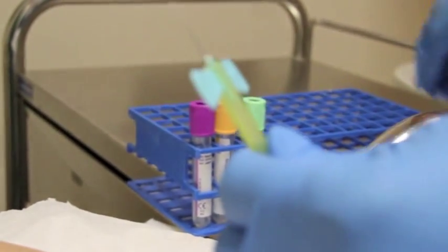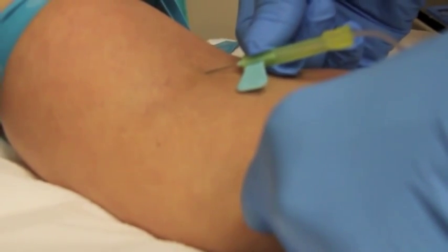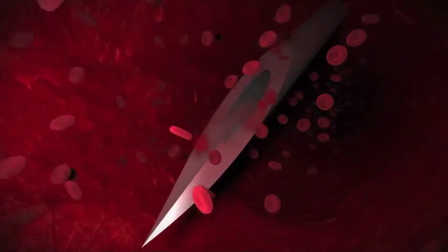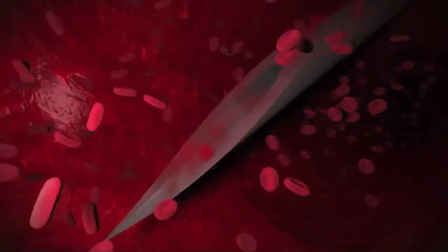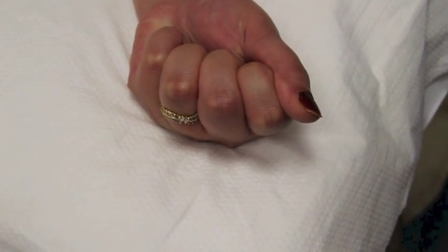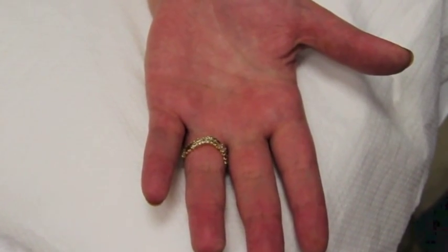The phlebotomist then introduces the needle into the vein, making sure that the angle of entry is between 15 and 30 degrees. This will accommodate the blood to flow easily into the needle and then pass through the tubing into the vacutainer, which holds the blood. The patient is requested to release the fist once the blood is flowing freely. The tourniquet is released within 1 minute and before the needle is removed from the vein.